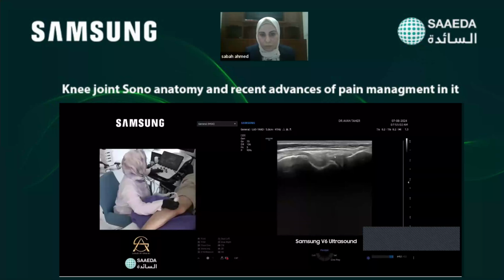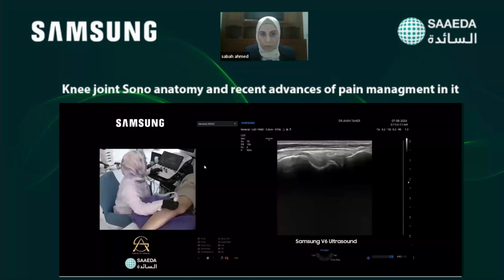Lateral meniscus, fibrocartilage, triangular, appears hyperechoic, and it's within its location, so it is not extruded and does not contain any hypoechoic or anechoic line that represents a tear. So this is a healthy meniscus.